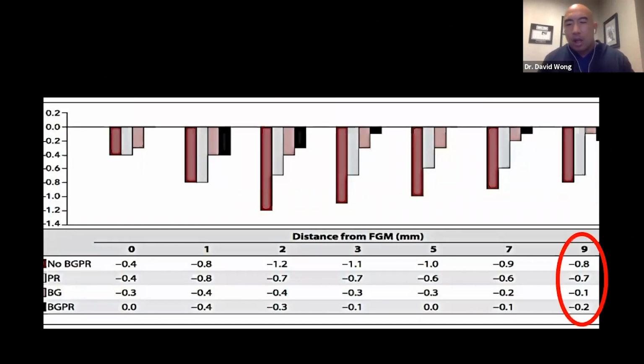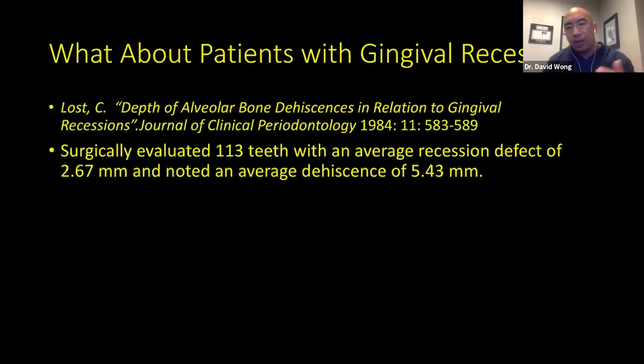When you take out a tooth, put an implant in, add a bone graft, after that, you can either do a wide healing cap or a provisional restoration, and you lose the least bone that way. When you don't put a bone graft in there and only put a straight healing abutment or even a provisional, that's when you lose more bone. So it's important to graft at the time of your implant placement.